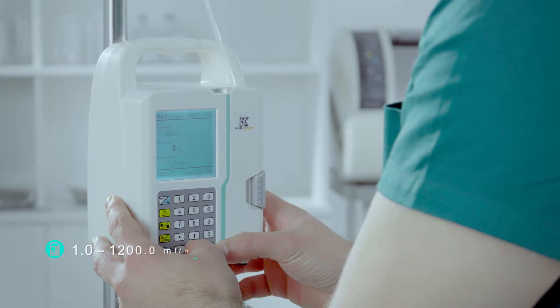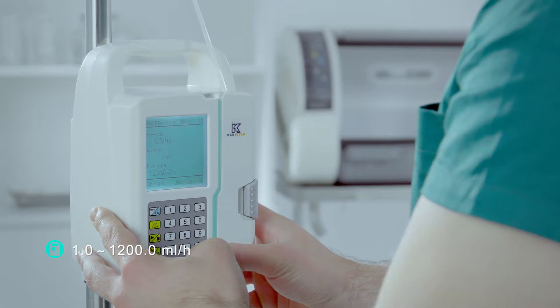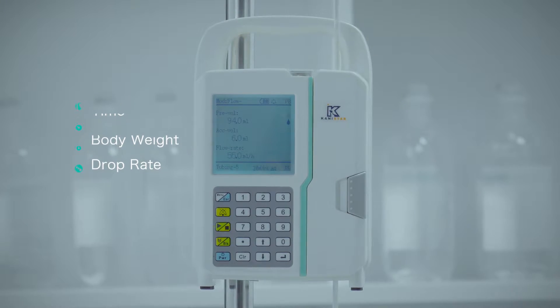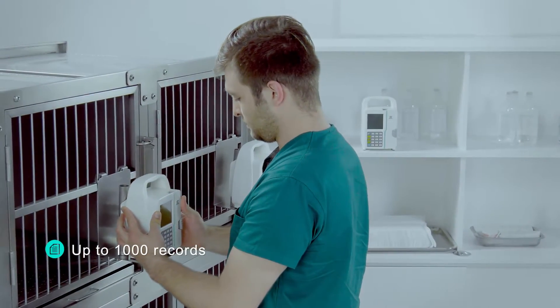Wide speed range from 1.0 to 1200.0 millilitres per hour. Four basic modes of operation are available for use. Historical records keep up to 1000 cases in memory.